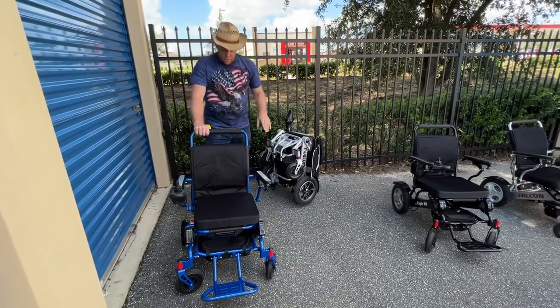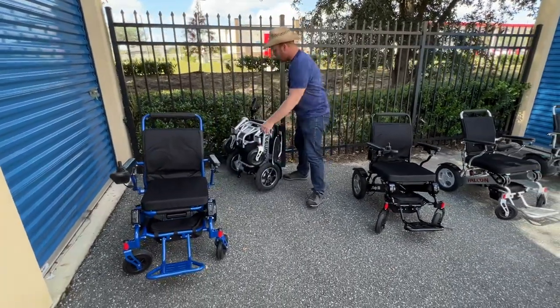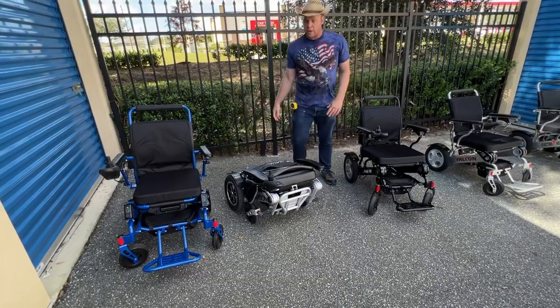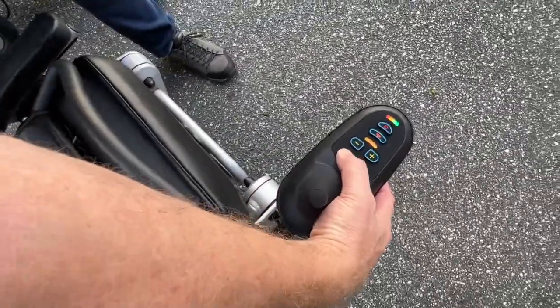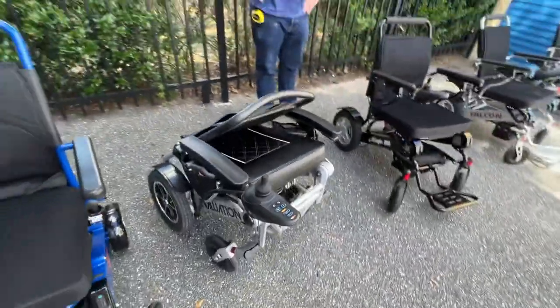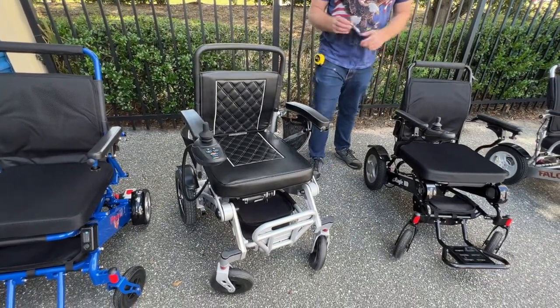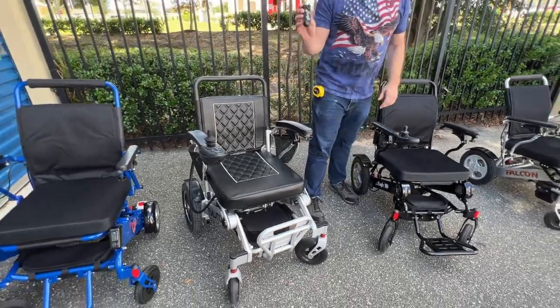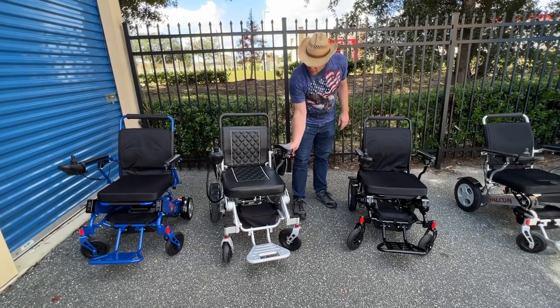Now we're going to go to the final chair — the Evaluation Evolution. This chair opens a little bit differently. I'm going to power the chair on and press the button that will turn it into open mode. It beeps three times and then the chair opens all by itself automatically. This chair also has a remote control that can be used to operate the chair up to 100 feet away and can be used to fold and unfold the chair.